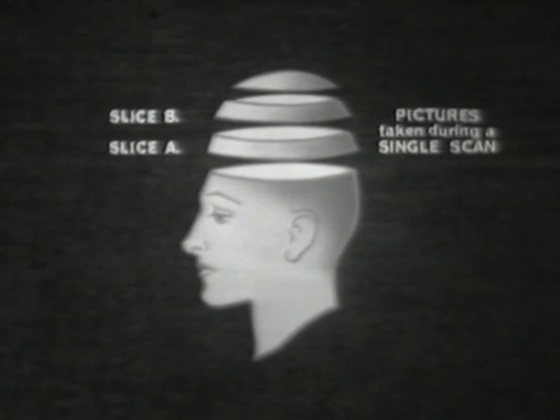Let us imagine that we are going to look at a cross-section of some part of the body, in our case the cranium. This will be a finite thickness, and we are going to irradiate it with a collimated beam of X-rays. Over the thickness of the slice, we can imagine that the beam will be nearly parallel and therefore of nearly constant dimensions. By using a system of crystal detectors, we can measure the number of photons entering at a particular point and the number of photons emerging at the corresponding exactly opposite point on the circumference.